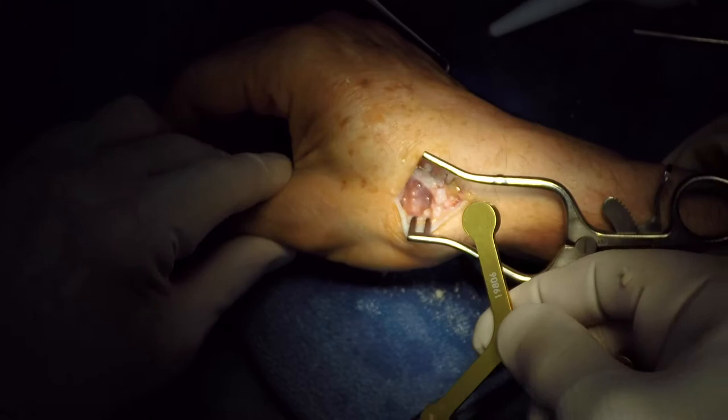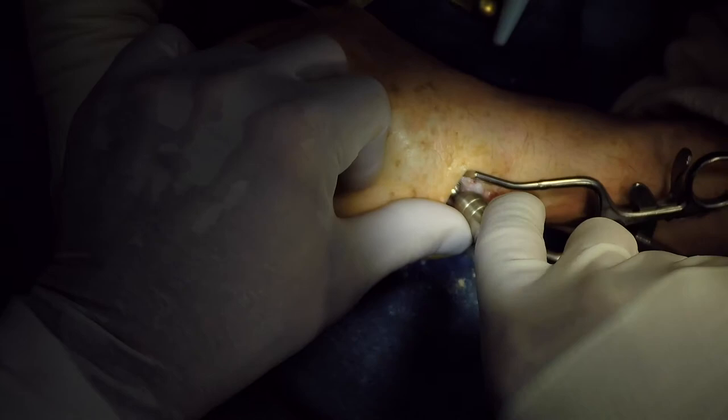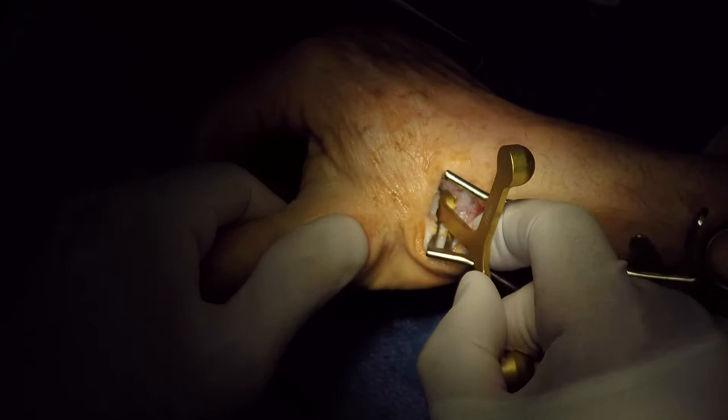The sizing guide will have zero, plus two, and plus four sizing depending upon the laxity. Once this is tested, this is a hemispherical broach which will widen the canal that was created by the burr to better sit the implant.